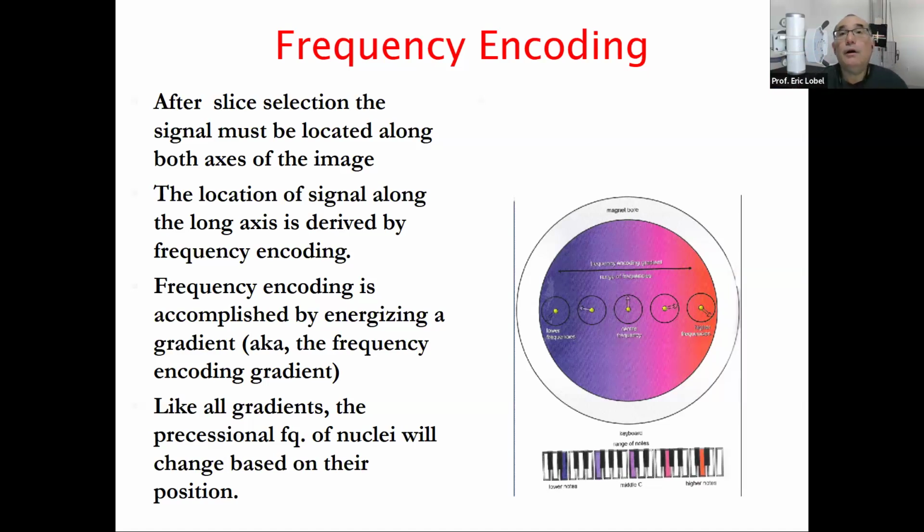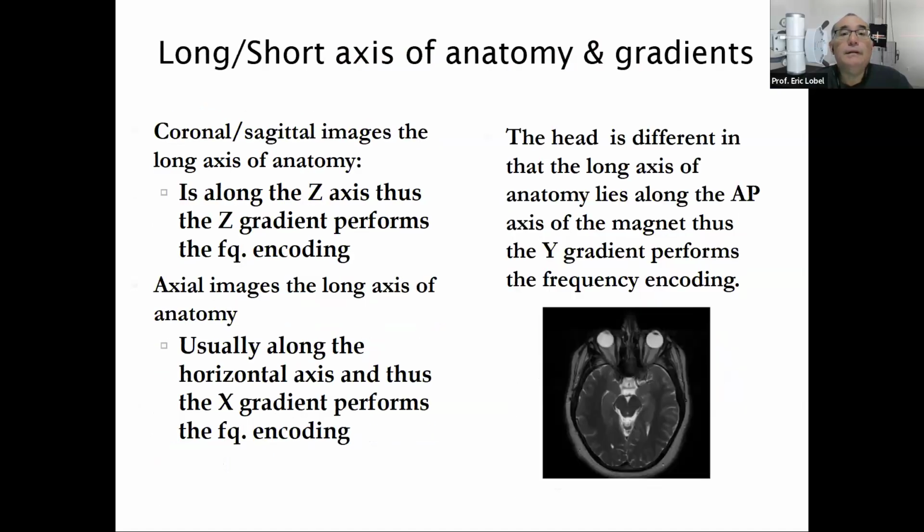So these are the spectrum of frequencies we are going to accept, with which the computer systems will then reconstruct into an actual image. So this receiver bandwidth will have an effect on signal to noise, right? When we have a narrow receiver bandwidth, we're going to have a higher signal, right?